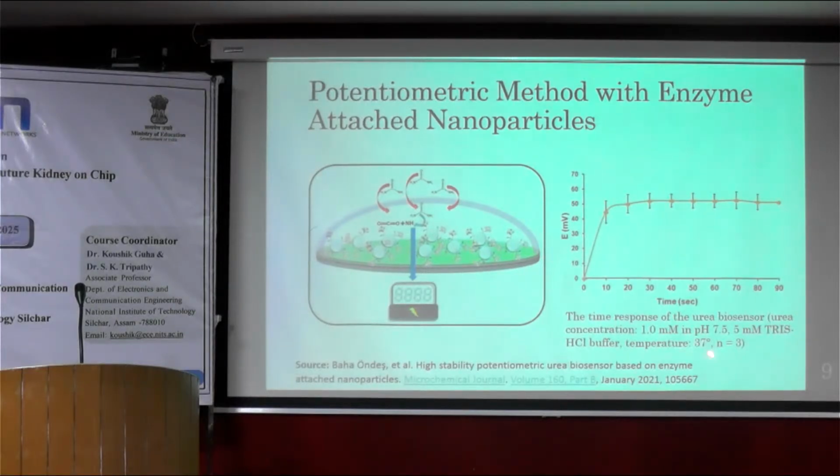The problem is that we need to make sure that the enzyme will be stable during long-term exploitation. This article covers the stability of this electrode within very long-term exploitation of this particular sensor, and they provide information that this sensor can work in a stable manner for a few dozens of days without changing the accuracy of this system.